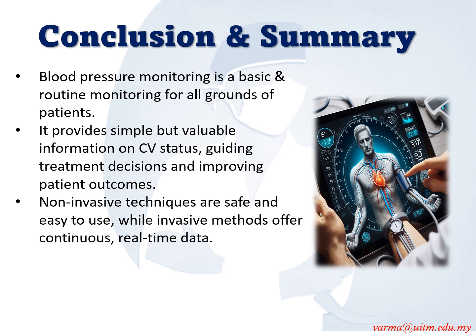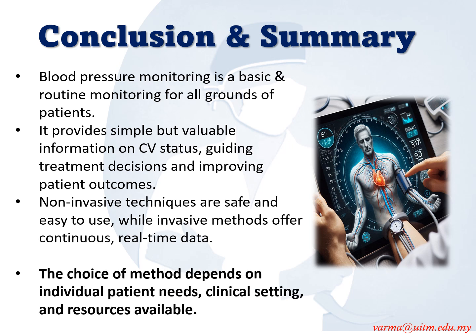So, for conclusion and summary, blood pressure monitoring is a basic and routine monitoring for all groups of patients. It provides simple but valuable information on cardiovascular status, guiding treatment decisions and improving patient outcomes. Non-invasive techniques are safe and easy to use, while invasive methods offer continuous real-time data. The choice of method depends on individual patient needs, clinical setting, and resources available.